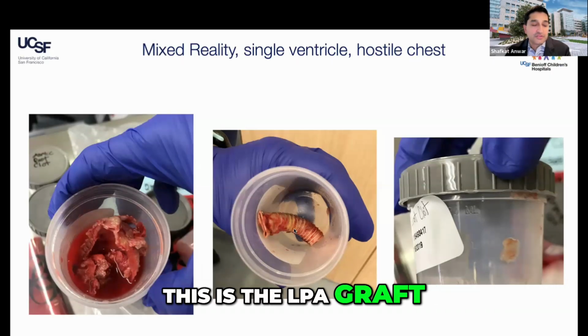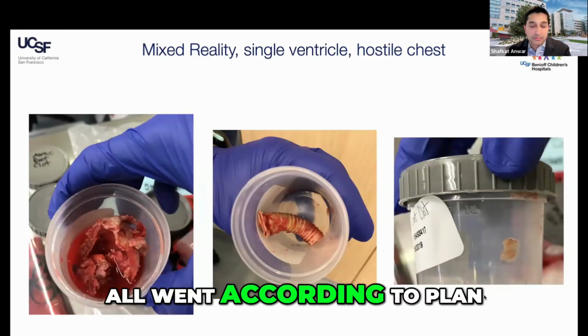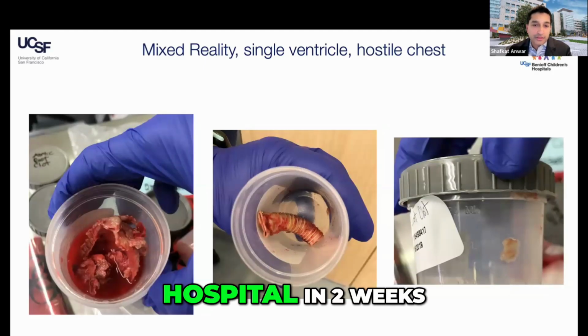This is the LPA graft, just like we had shown. And this is the clot inside the coronary artery. All went according to plan. The patient made it out of the OR. Thankfully, the cardiac function recovered and she left our hospital in 2 weeks.